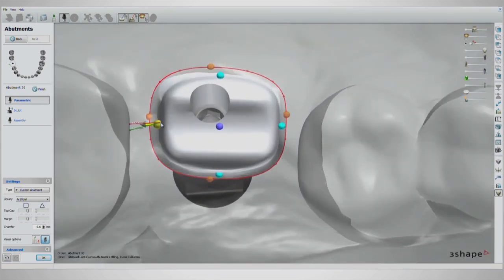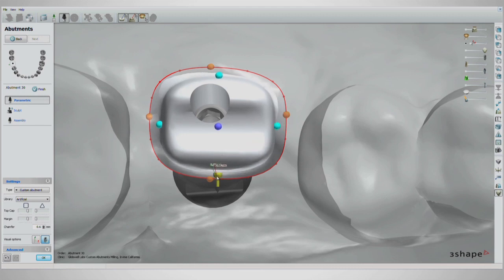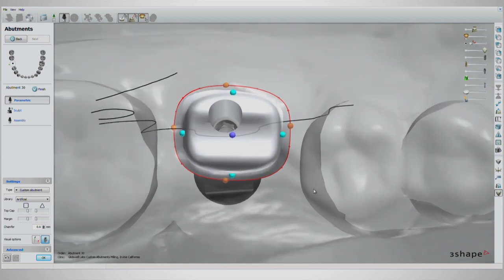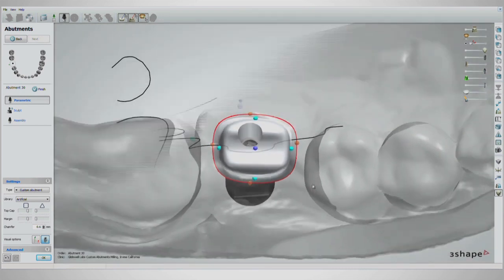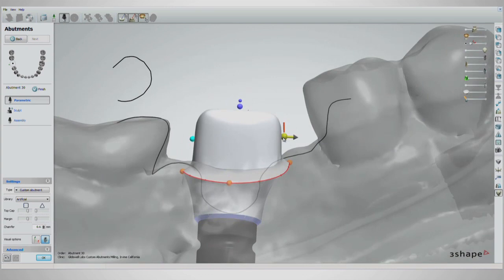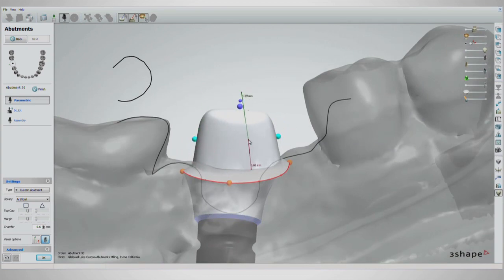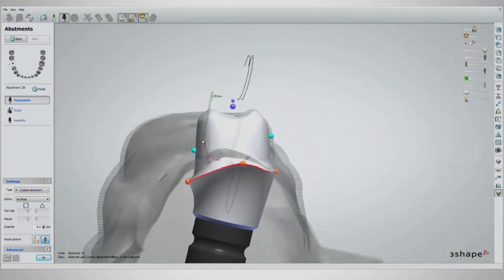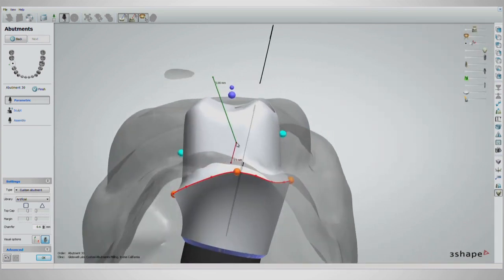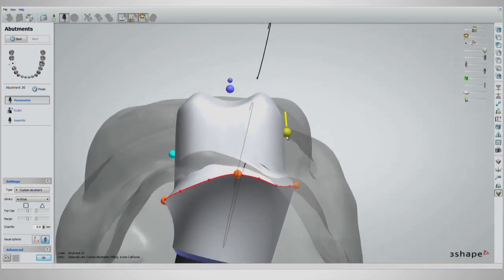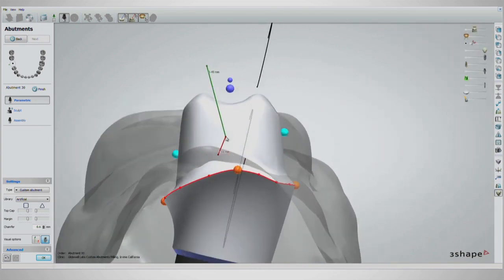You can move the body walls of the abutment with the blue handles. On the mesial, distal, buccal and lingual sides, put the cursor on the blue handles and scroll with the mouse. This will taper the abutment for an easier insertion direction.